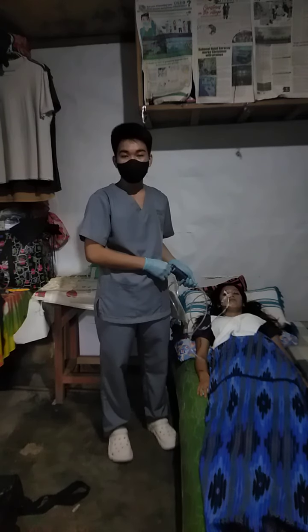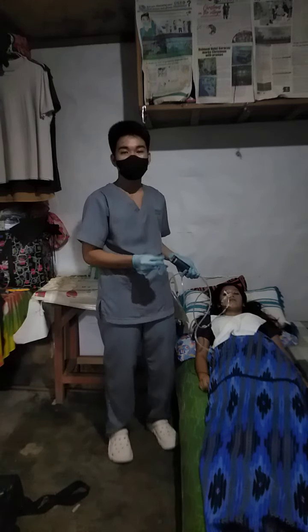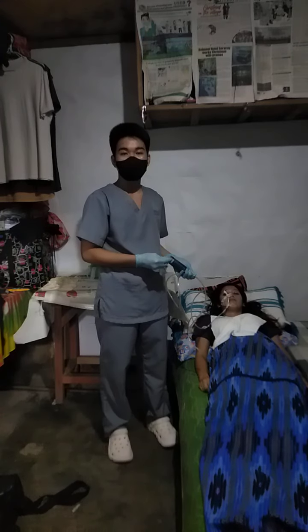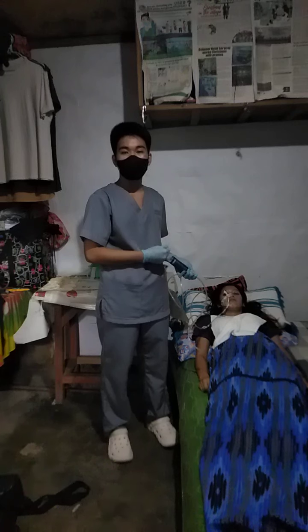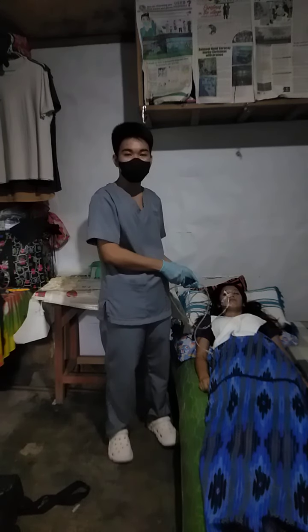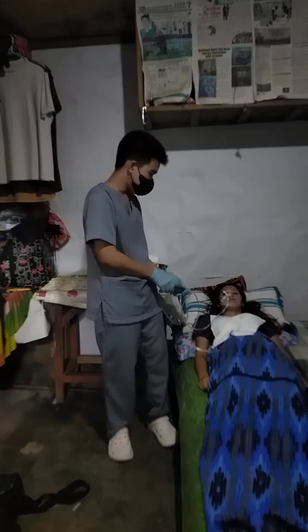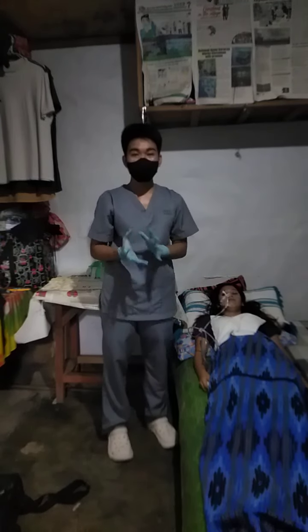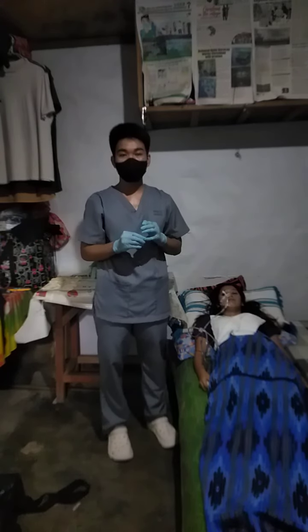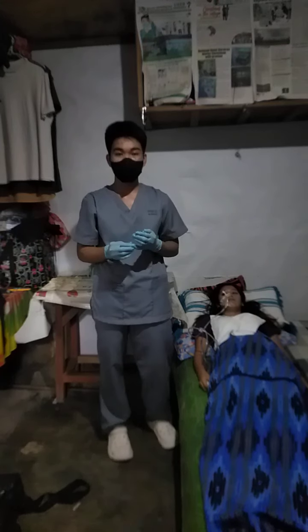Obtain a radiograph or X-ray of the tube placement, based on the facility and as ordered by the physician. The X-ray is considered the most reliable method for identifying the position of the NG tube. Remove gloves. Then secure the tube with a commercially prepared device or tape to the patient's nose.